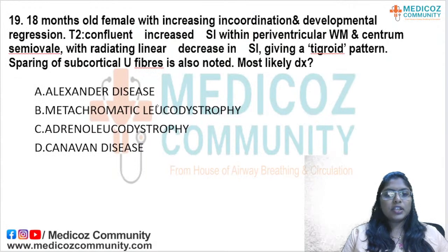Coming to the next question. 18 months old female with increasing incoordination and developmental regression. T2 confluent increased signal intensity with periventricular white matter and centrum semiovale with radiating linear decrease in signal intensity giving a tigroid pattern. Sparing of subcortical U fibers is also noted.